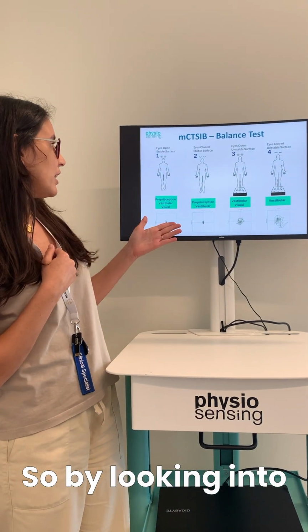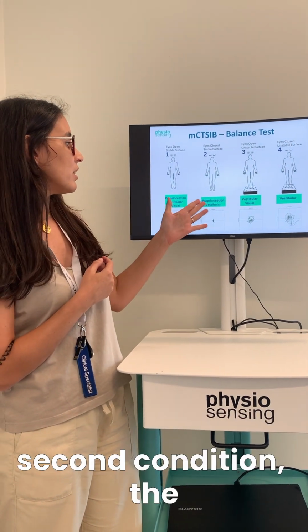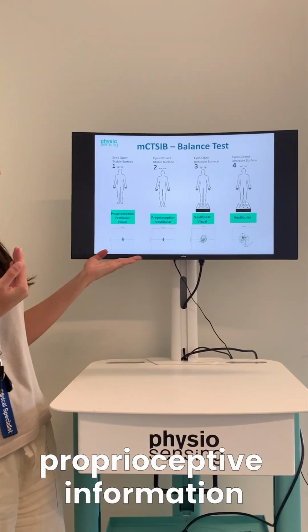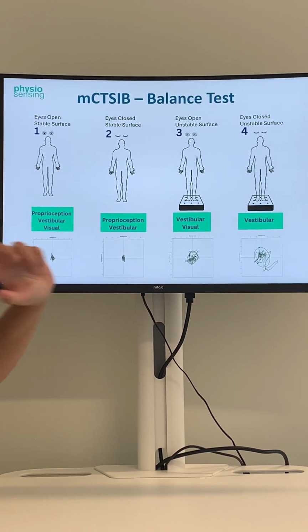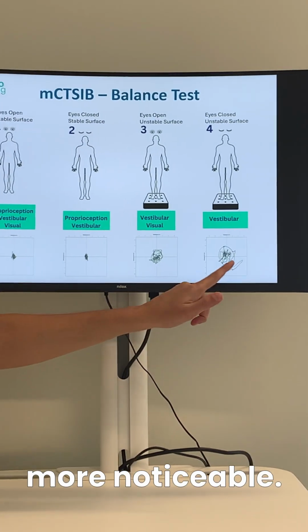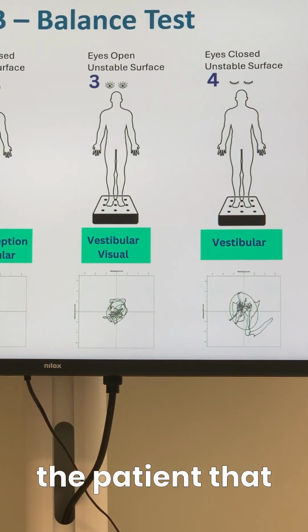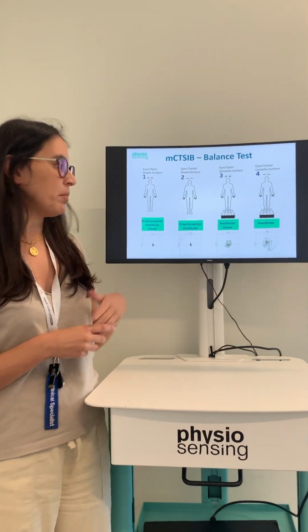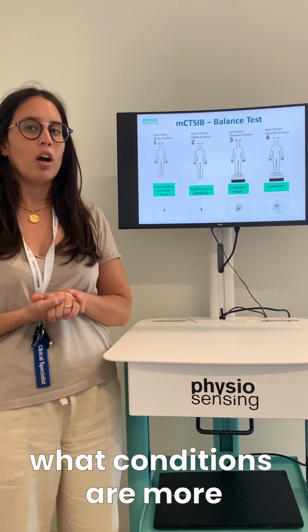So by looking into each condition, we can understand that, for example, in this case, on the first and on the second condition, the patient was very stable. And this means that he was using the proprioceptive information a lot to maintain balance. When we had the foam pad, his body sway significantly increased, and on the fourth, this is even more noticeable. We are talking about a patient that is 84 years old, and he has a bilateral vestibular hypofunction. But this is a very simple way to look into the stability level of this patient and assess what conditions are more challenging for him.